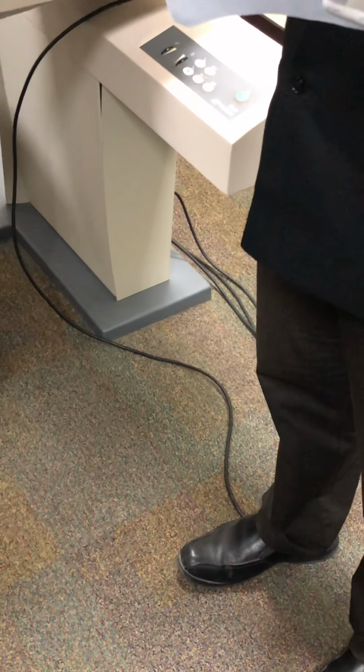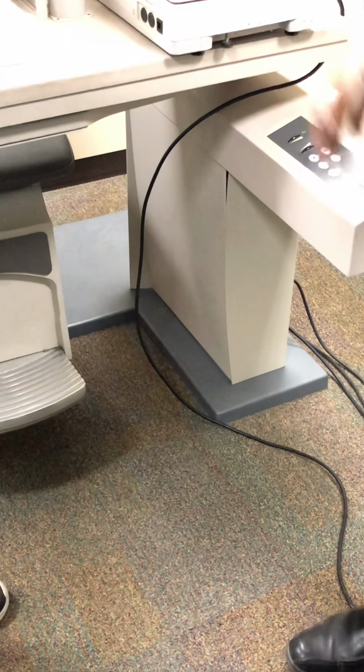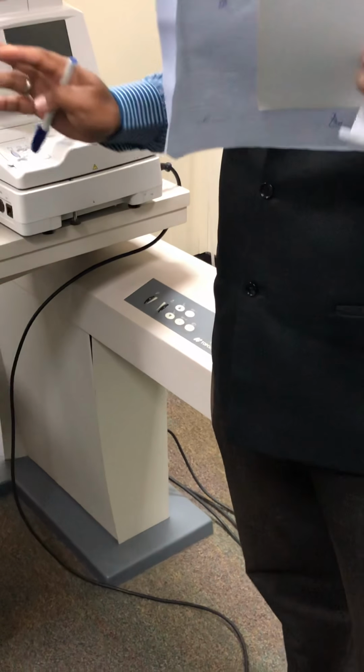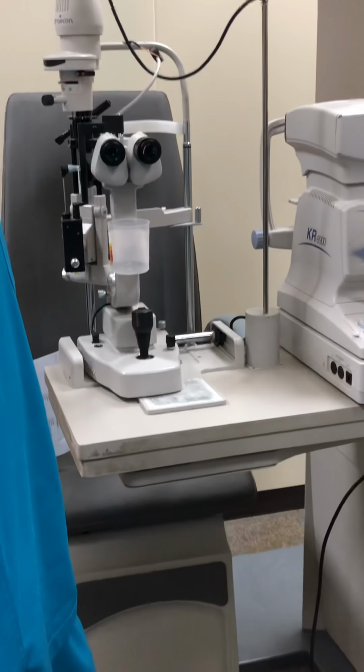If both are the same, then keep the maximum visual acuity line. 6/6 is the maximum visual acuity, and you show a 6/9 line. If it is not equally balanced, then you have to make either the upper one or the lower one clear. The idea is to balance both eyes. You either blur both eyes or clear both eyes. How would you clear it? By increasing or decreasing the spherical power, with the spherical power only.